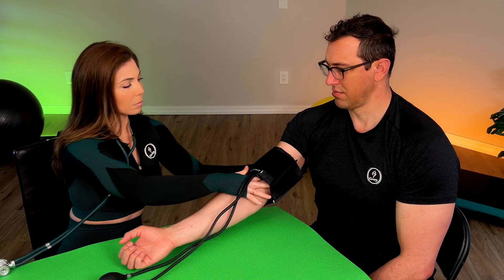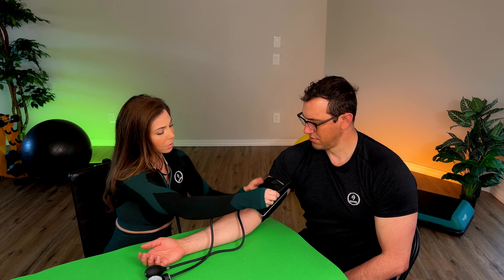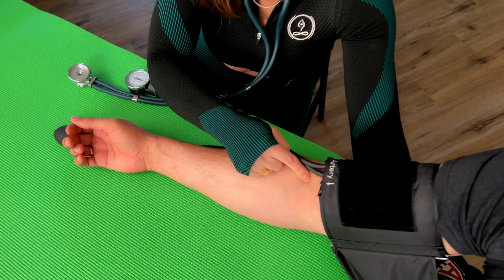Getting started: you put the cuff around the individual's arm. It doesn't really matter which arm you put it on. Usually, the dominant arm may have a slightly higher reading than the non-dominant arm, so in general it's an okay practice to take the measurement on both arms and compare. However, it's generally okay to just pick an arm. Shimmy the cuff up to the upper arm and ensure that there is a distance of about an inch from the crease of the elbow.